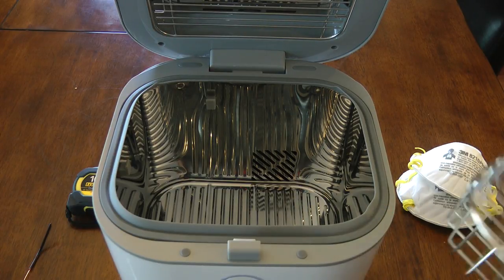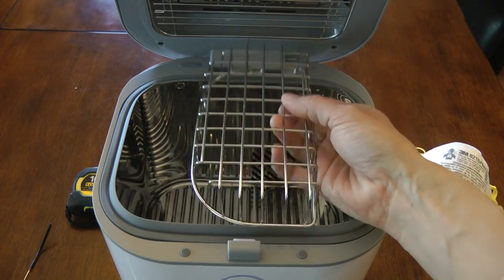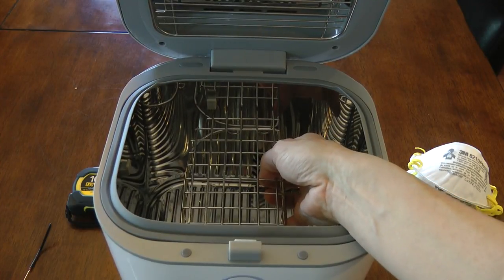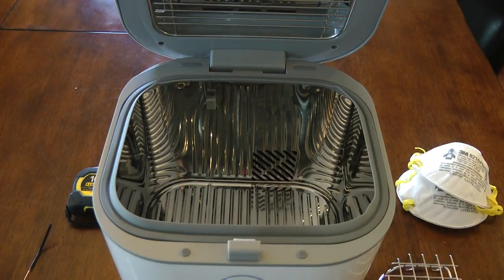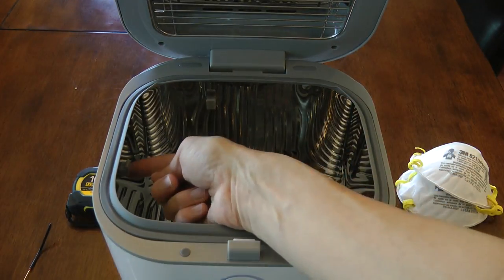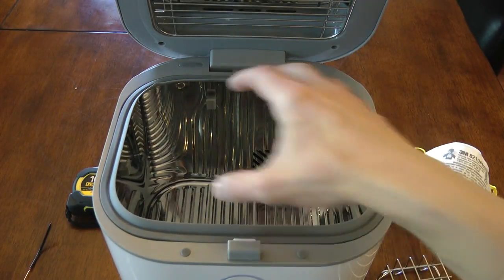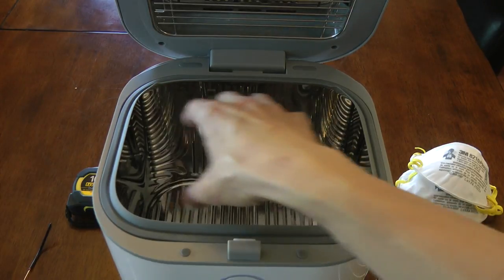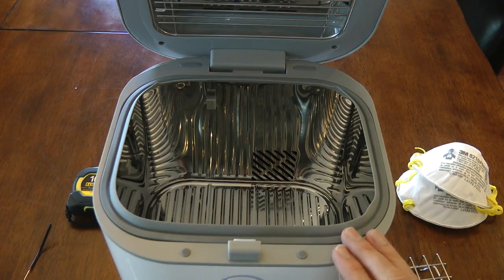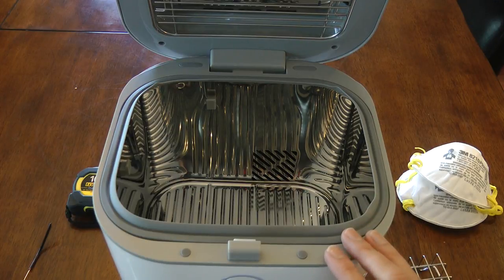Instead, what I've done is come up with a way to take the existing basket, turn it upside down, put some hooks inside the chamber, and let the basket rest on those hooks. The mask then sits on top of the basket, and hooks on each side let the mask rest against them. When you're finished, two masks can sit side by side much closer to the bulbs, exposed to much more UV light.